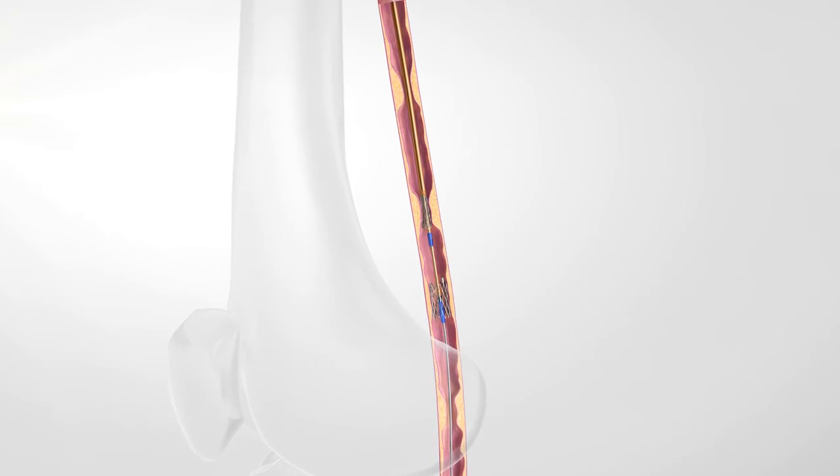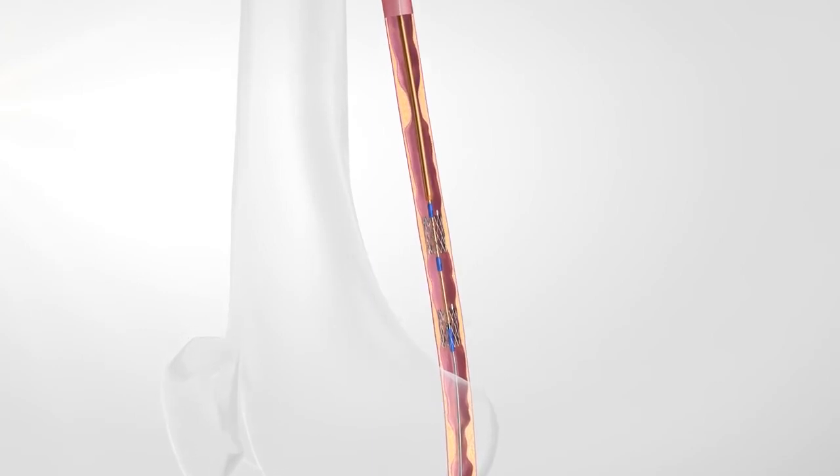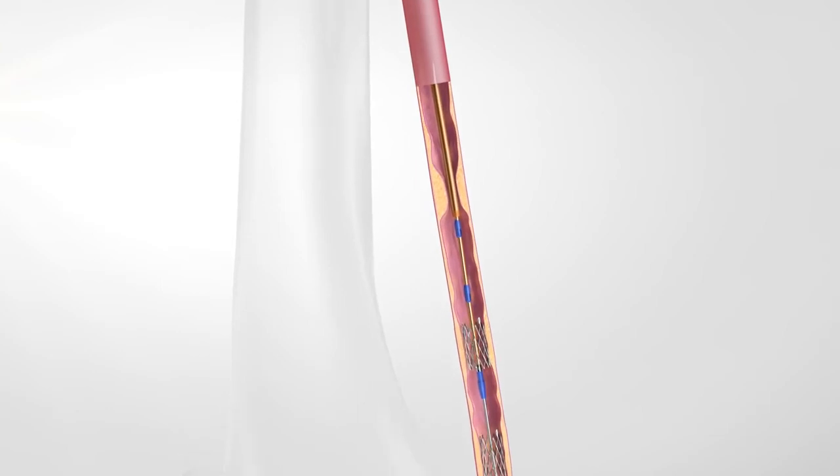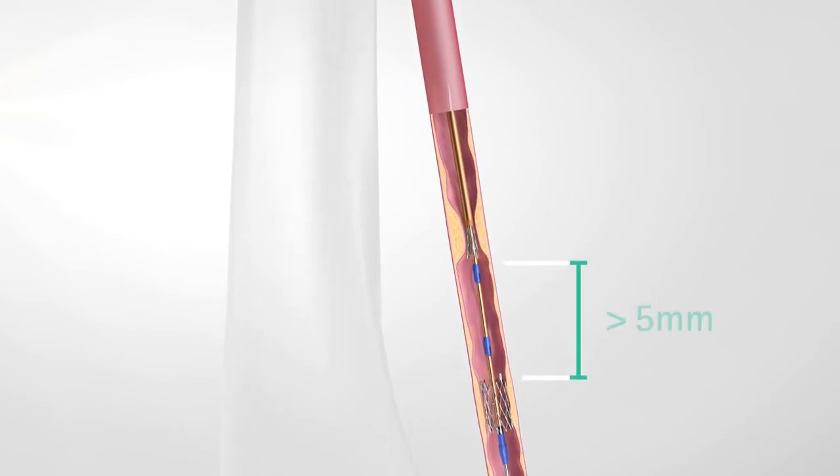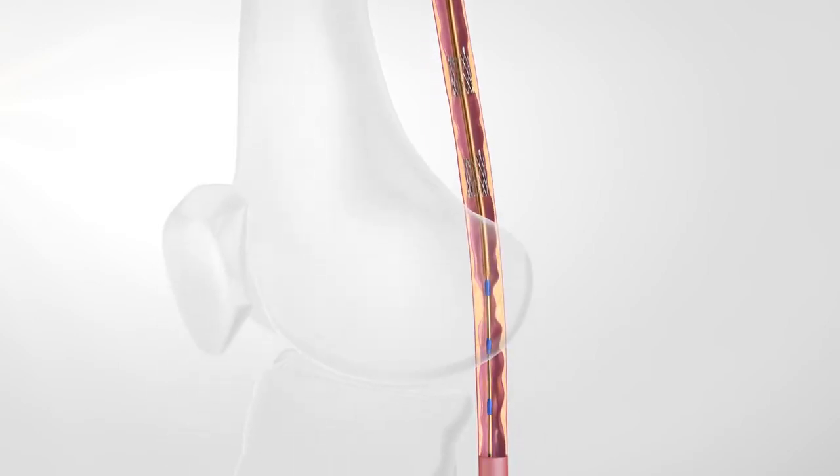Each stent can be implanted only where its scaffolding properties are needed. A distance of at least five millimeters between neighboring stents is recommended. Already implanted stents can be passed to release additional stents distal of the previously treated lesion.